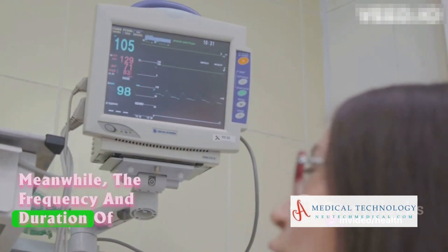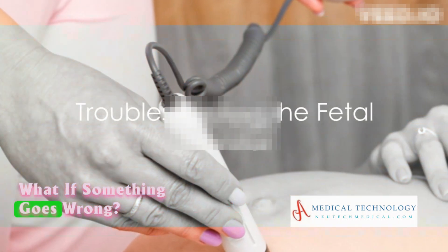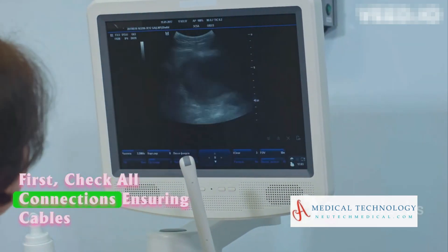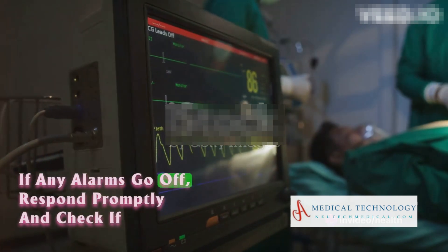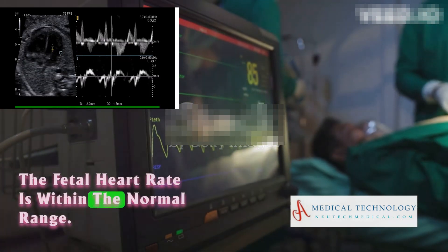Meanwhile, the frequency and duration of uterine contractions are also monitored. But what if something goes wrong? Troubleshooting a fetal monitor involves a few steps. First, check all connections, ensuring cables and sensors are properly connected and the transducer is placed correctly. If any alarms go off, respond promptly and check if the fetal heart rate is within the normal range.